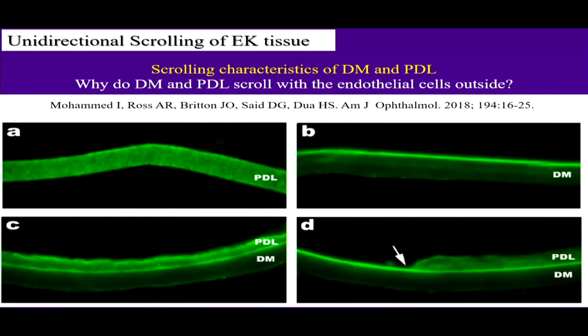Now look at this staining. All that is green is elastin. So this is the pre-Descemet's layer, has elastin all over it, all through the tissue. This is Descemet's membrane from here to here. And are you seeing my arrow? No, you're not seeing my arrow, sorry.